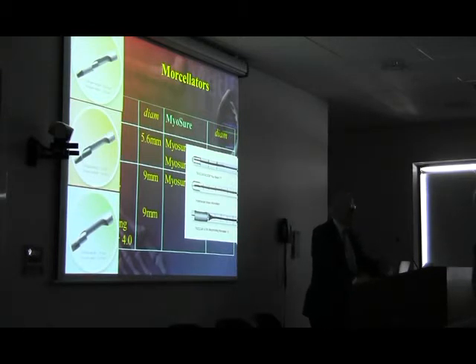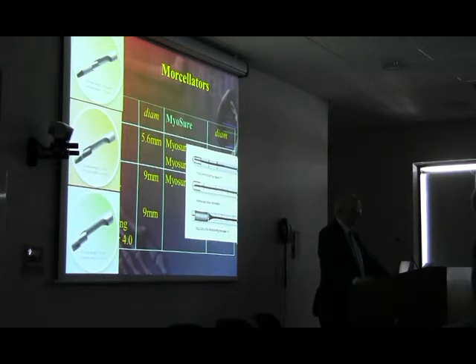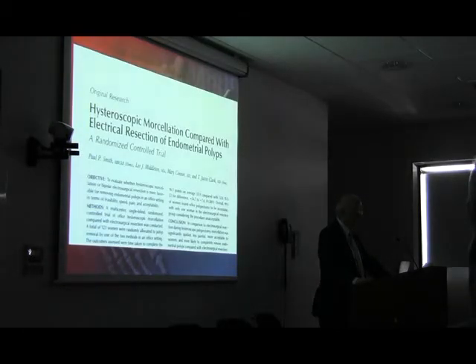And this is the other one. It's similar, quite similar in ways. But as Mark Hans points out, visualization can be very difficult when there's only a single flow, which is crucial, I think, to being able to see what's happening.